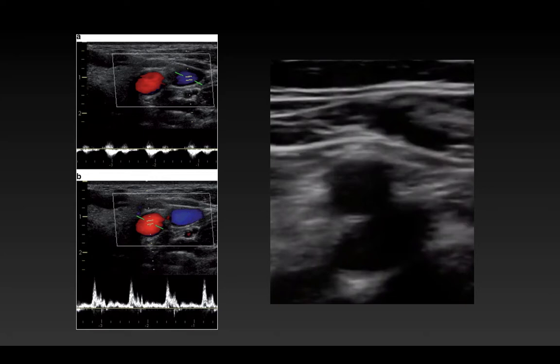It's important to assess anatomy because you might find something you're not expecting. On the right side of the screen, the artery is directly overlying the vein, making an approach very difficult.